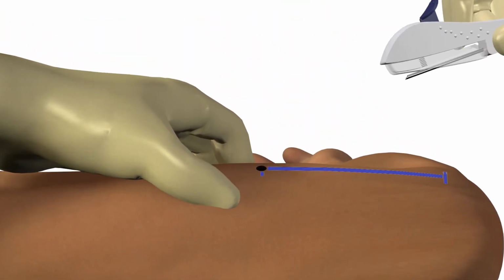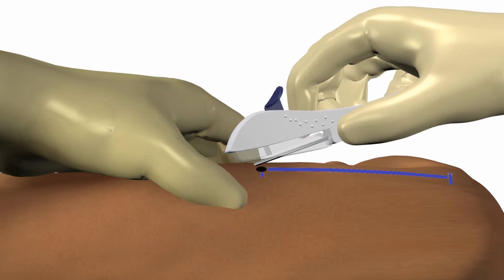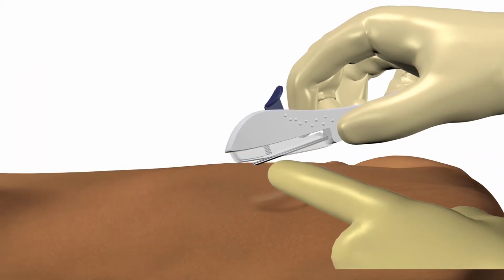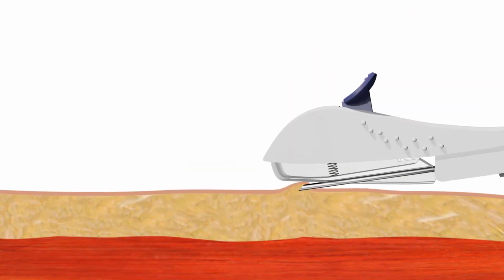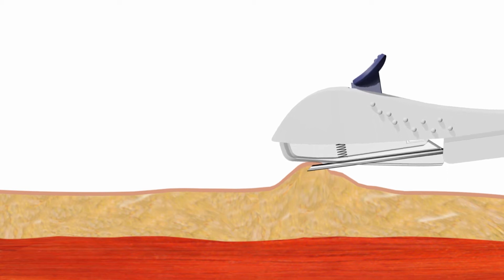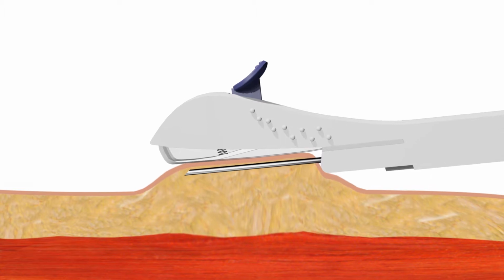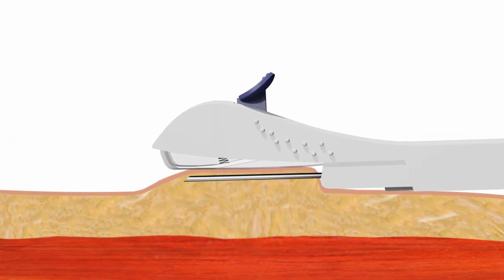Stretch the skin around the insertion site with your thumb and index finger. Puncture the skin with the tip of the needle slightly angled less than 30 degrees. During the entire insertion procedure, you should be able to see the insertion site and the movement of the needle. Lower the applicator to a horizontal position. While lifting the skin, also known as tenting, gently insert the needle. Make sure the needle is inserted to its full length. If the needle is not inserted to its full length, the implant may protrude from the insertion site.